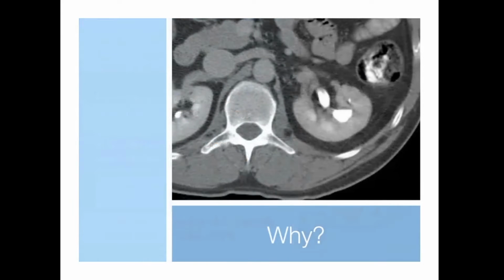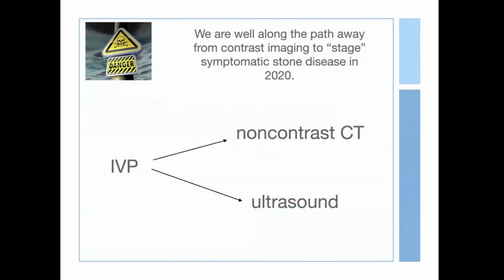Why is that? Well, this stone is actually located in a Caliceal Diverticulum, something that was not appreciated from the non-contrast CT. And this is an important issue because we're well along the path away from contrast imaging to work up most symptomatic stones in the emergency room.